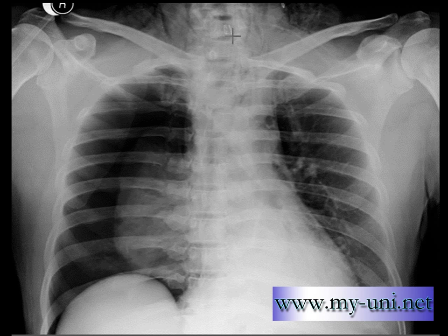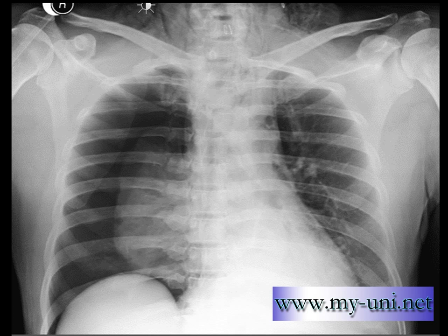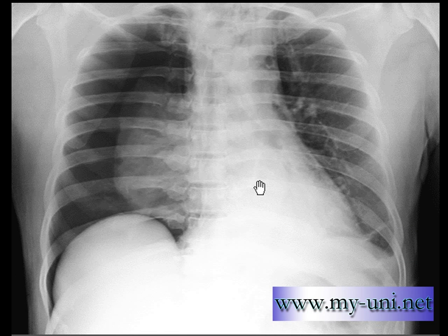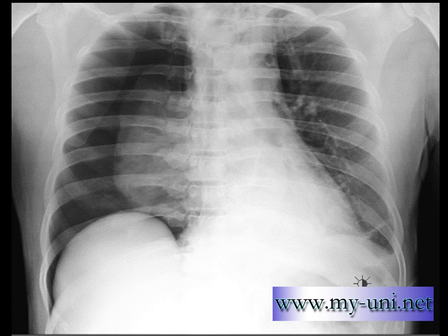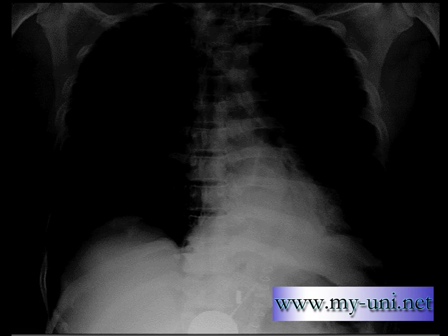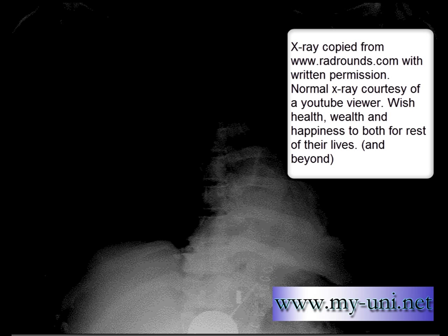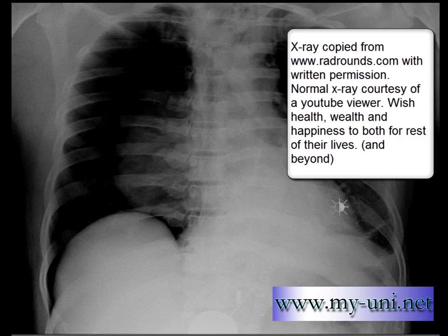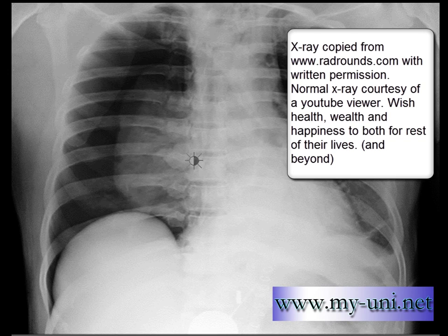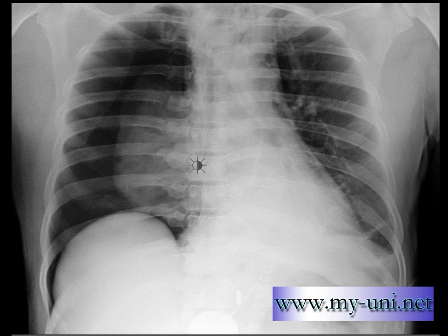I can see a surgical suture here in the neck, and I can also see air density within the soft tissue around the neck, which is surgical emphysema. If you go inferiorly and try to change your window level settings, you can see some metallic sutures here. This is a post-operative patient.